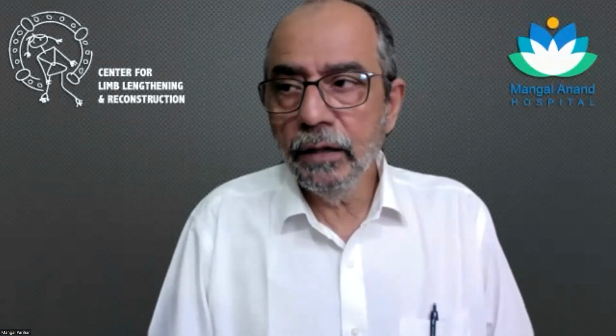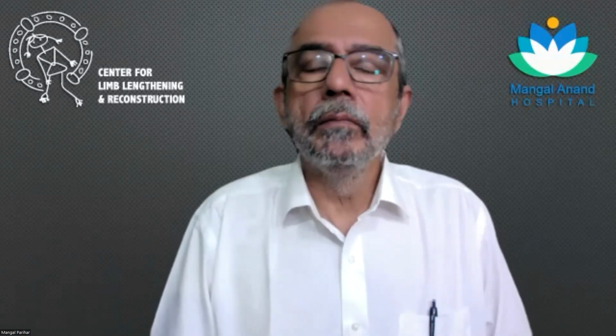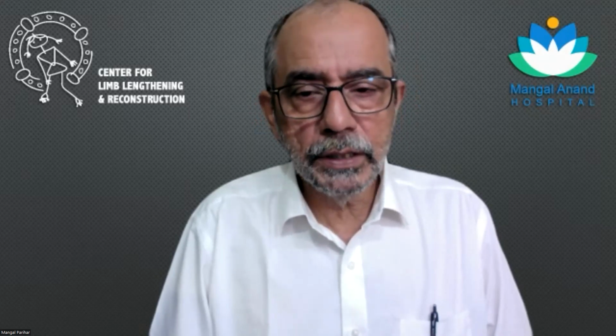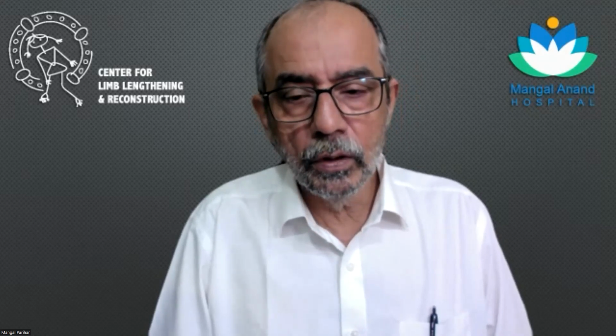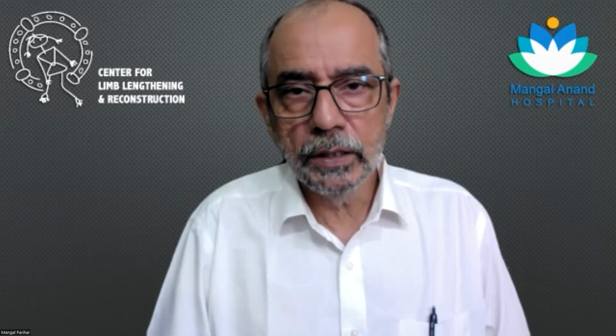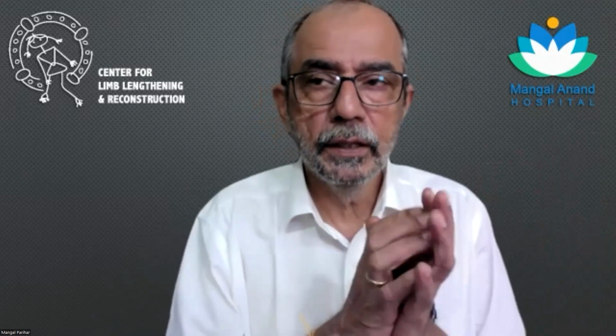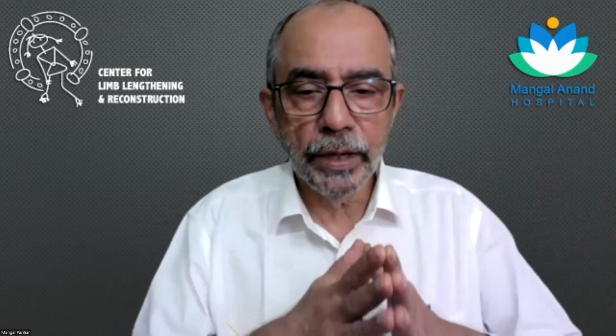My reasoning for doing the double osteotomy when I do it is that, number one, it reduces the amount of correction I need to do in the tibia, because the more you are, and especially if you're doing it with some form of internal fixation, you get to open less of a wedge.